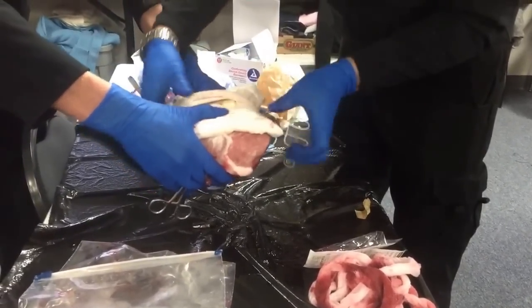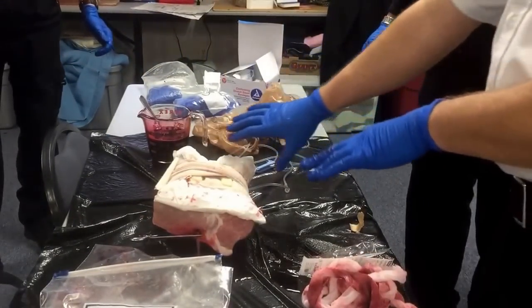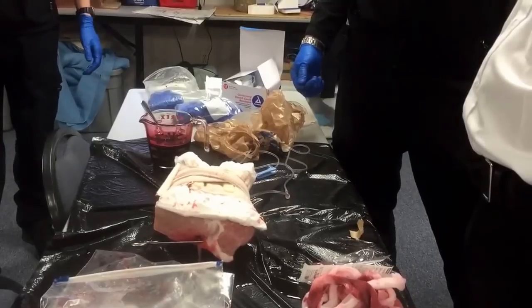Get the end and secure it in place. Of course, we continue to have the extremity elevated for bleeding control. And reassess the patient.